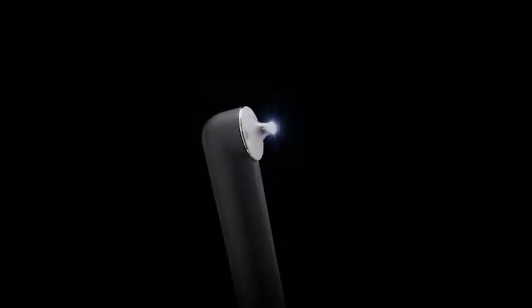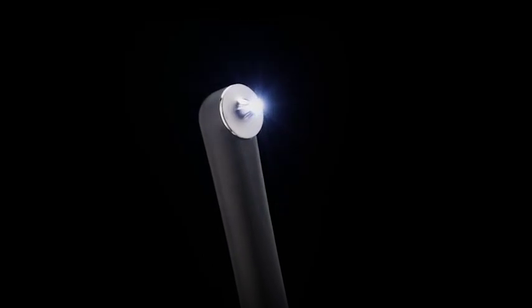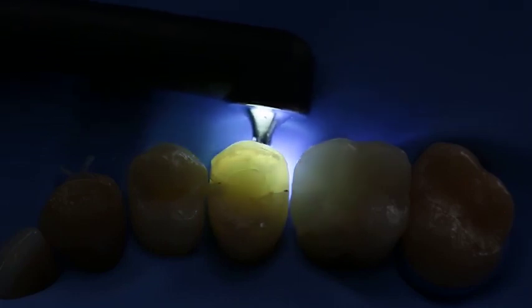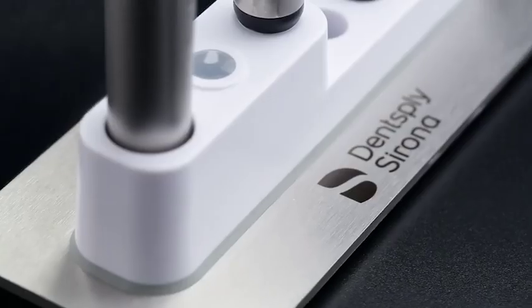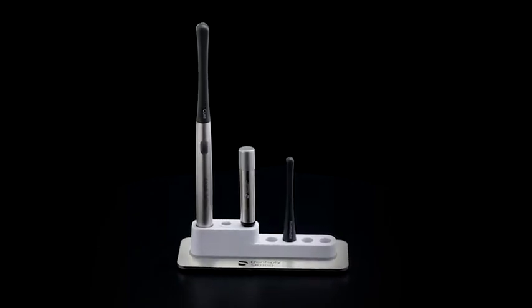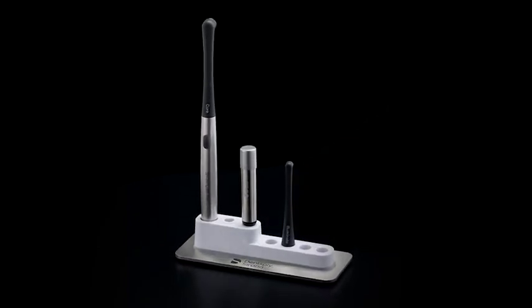For example, the specially designed trans illumination tip helps you locate caries, crown fractures and root canal orifices. And the multifunctional charging base provides room for extra tips to meet your needs as dental technologies continue to advance.